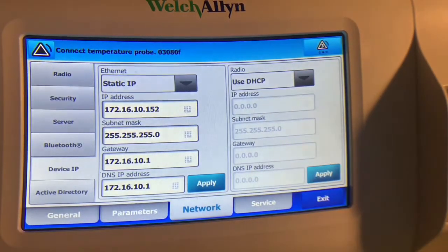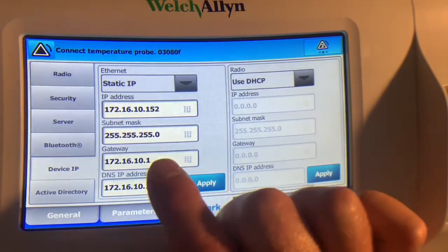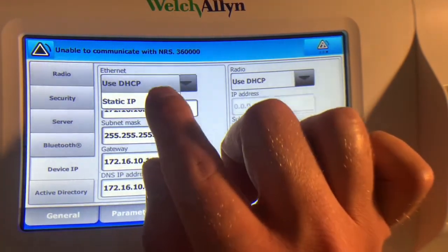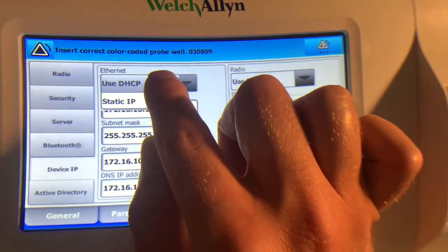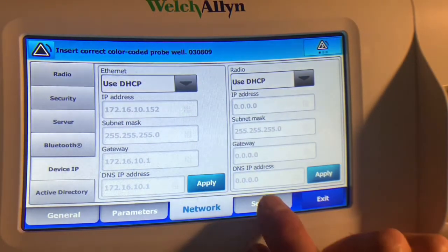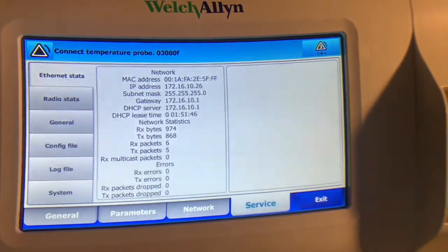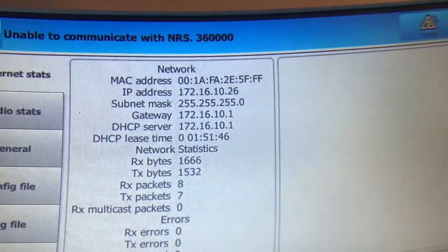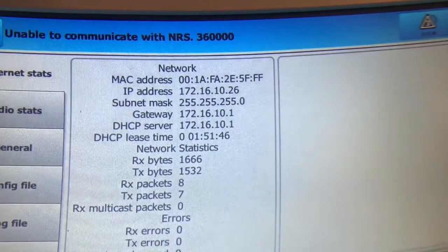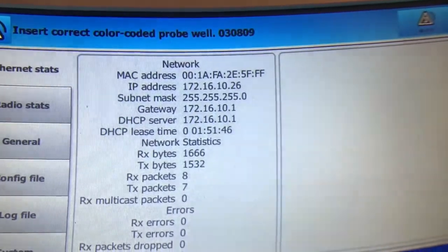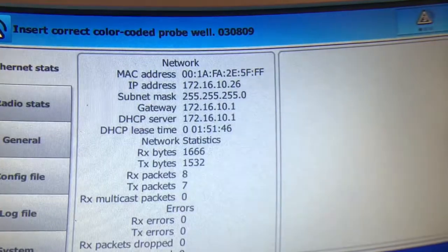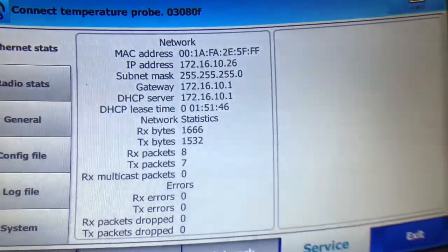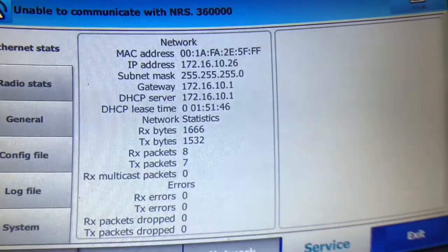There is a DHCP server on this network, so I don't have to necessarily enter in this information. I can just go back up here, select use DHCP and press apply. And then go back to service and I can see here it's giving me a different IP address now, one that's been dynamically assigned, and it's also given the gateway and the DHCP address.